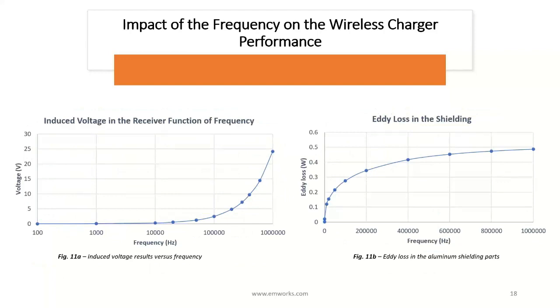As we said, in the previous slide we have seen that the coupling coefficient decreases with the frequency, but the induced voltage of the receiver has a different behavior. It increases when the frequency becomes higher. The voltage is directly proportional to the frequency and has a greater impact than the coupling coefficient. So now we can get a higher induced voltage by increasing the frequency.